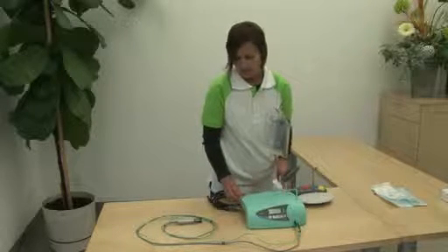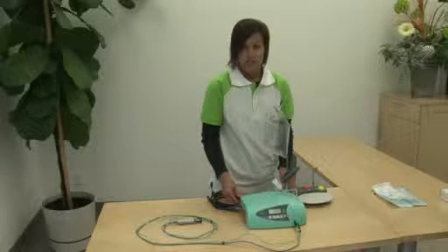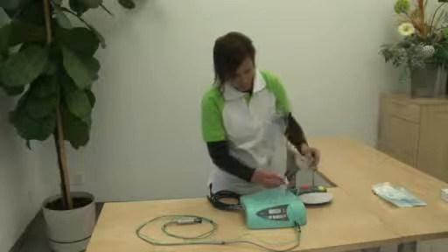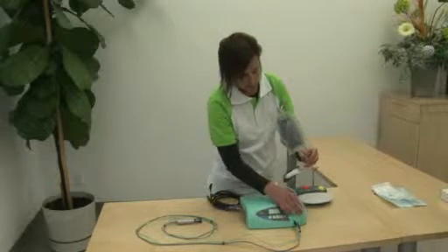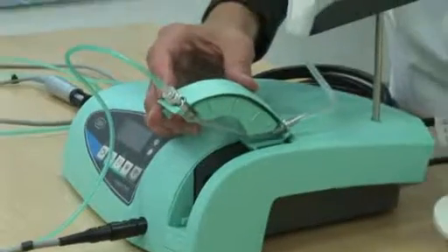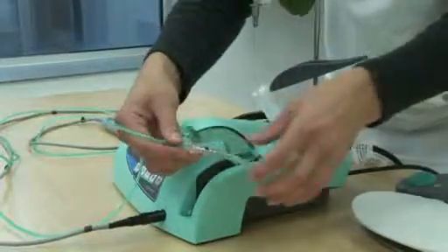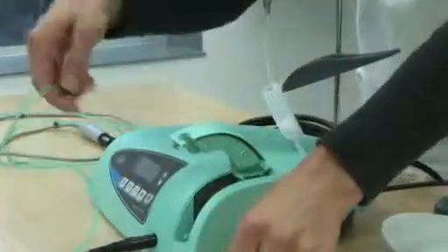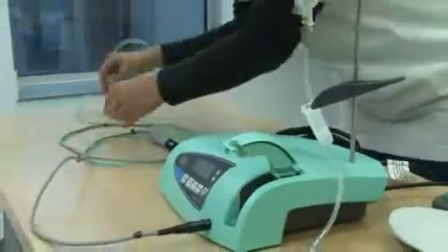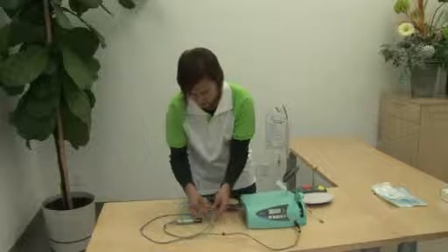Then hang the bag on the stand to ensure that it doesn't drip if there is any leakage on the console. That completes the installation of the alternate tubing irrigation. The main differences between this irrigation and our standard irrigation tubing set is that the spike and the pump tube need to be cleaned after each surgery, and the green tubing is a one-time use only and needs to be discarded right after you are done with your surgery.